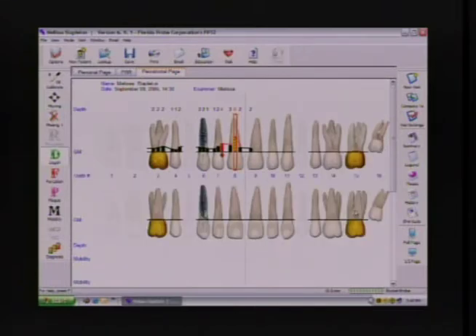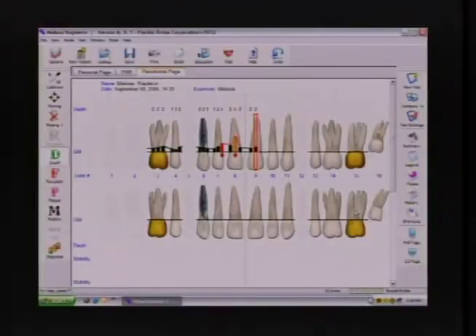Entering pocket depth. Now you can quick tap record your bleeding. Bleeding. And use the center pedal to advance. Midline. Without changing data. Go ahead on to your next site and you would resume probing. 2. 2. 2. 3.